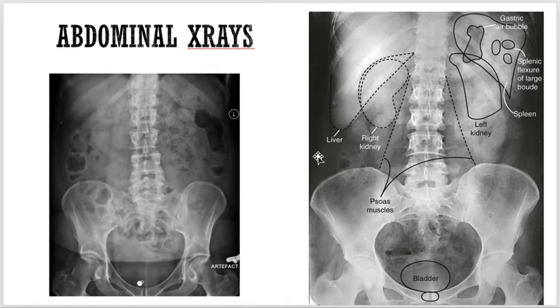Okay, you do not have to remember too many details, but normally the diameter of the large bowel is around 5.5 centimeter, and the small bowel is around 3.5 centimeter, right? So the presence of this gas in the intestines lets us calculate the diameter of them, right? This assessment changes between different people. But for example, if the large intestine is too much dilated, like 8 centimeter or above, of course it means they have some pathology.